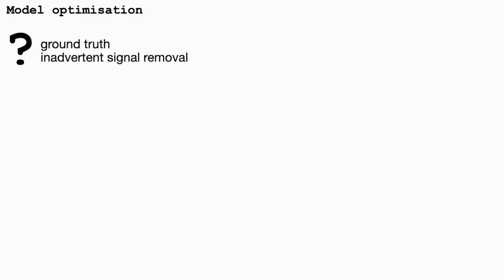The problem is how to apply a model which is optimal, because the conceptual problem here is that we don't have a ground truth for what is the best model. And if we are going to be too conservative and apply too sophisticated a model, we may inadvertently remove signal, which in the settings of fetal fMRI is quite undesired. We already operate at a very low signal-to-noise ratio regime.